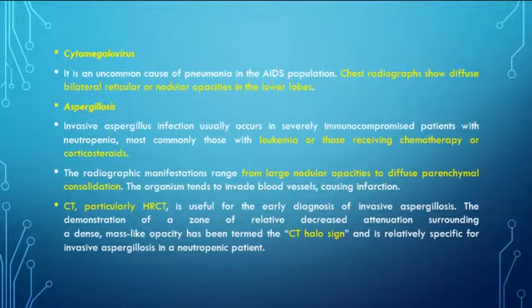Cytomegalovirus is an uncommon cause of pneumonia in the AIDS population. Chest radiographs show diffuse bilateral, reticular, or nodular opacities in the lower lobes.